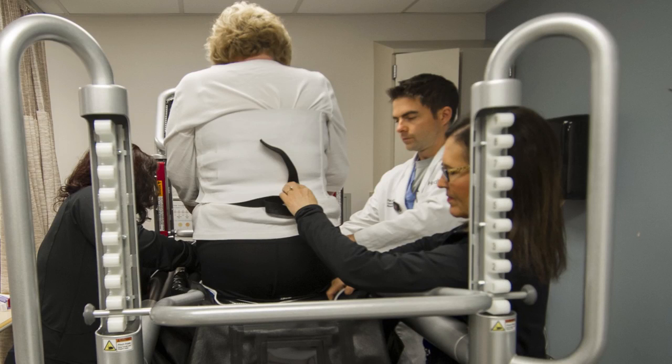What they've basically devised is a standard treadmill which has incorporated in it a balloon, a series of neoprene shorts that the patient can wear that then zip into the balloon. The balloon is then filled with air, and the pressure of the air lifts the patient up, essentially unweighting the patient, becoming an anti-gravity force. This technology was originally and is currently applied in the rehabilitation of patients with injuries, and particularly sports injuries.